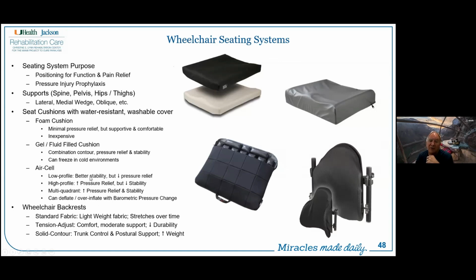Low profile provides better stability, but still not the stability that you get out of the gel and fluid-filled cushions. You don't get as much pressure relief with the low profile as you do with the high profile, but the high profile reduces stability within the seating system. You can have the multi-quadrant cushions so that you can quarter this out depending upon what you need for pressure relief and stability.